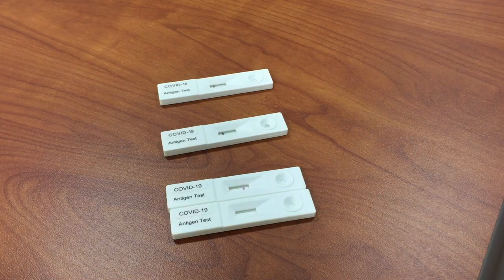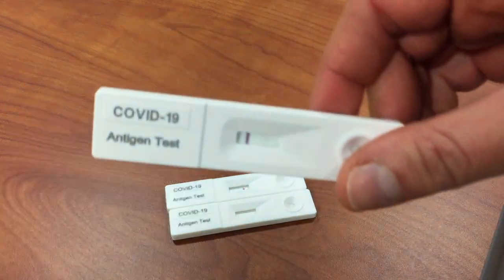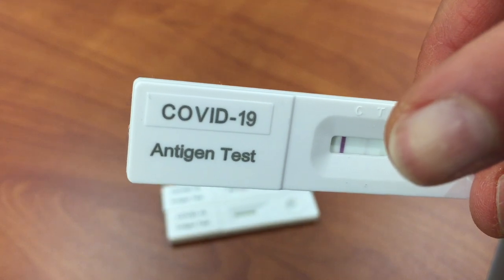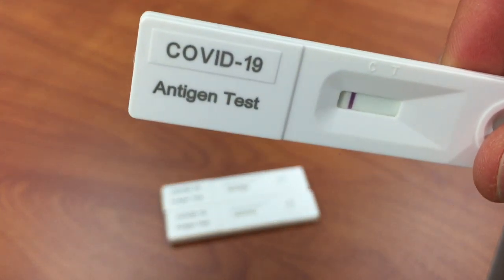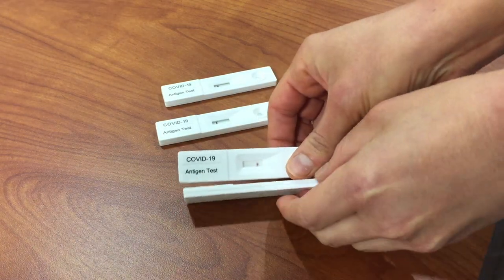Read your test results after the recommended time and follow the directions to see if your results are positive. See the faint little line? That's positive. Negative — no faint little line. Or invalid.